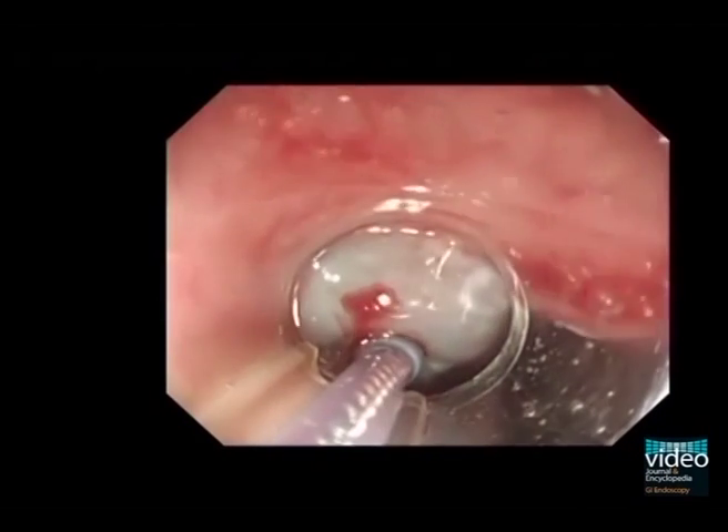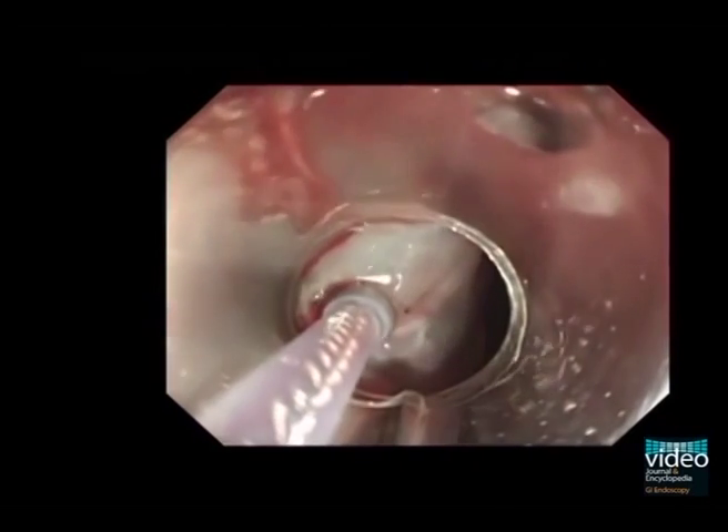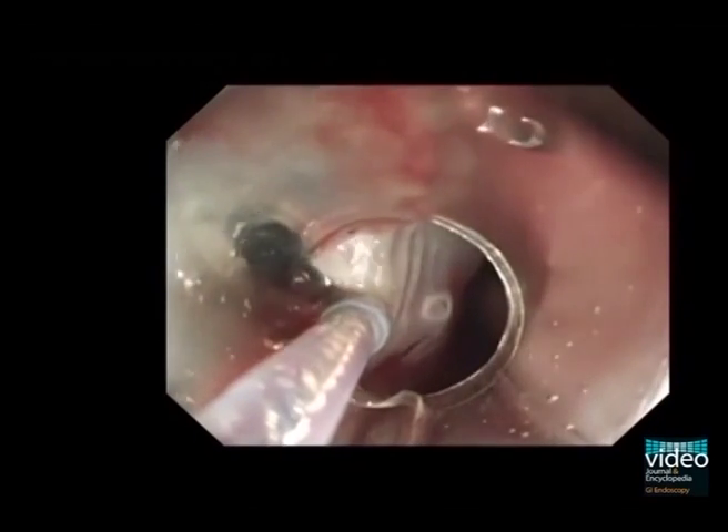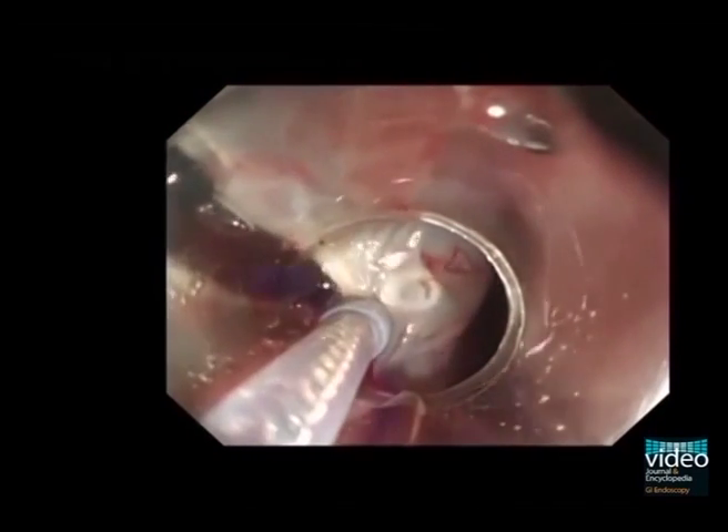After a small calibre tip transparent hood was fitted onto the tip of the endoscope, sodium hyaluronate solution was injected into the submucosal layer. After sufficient injection of solution, the procedure continued.